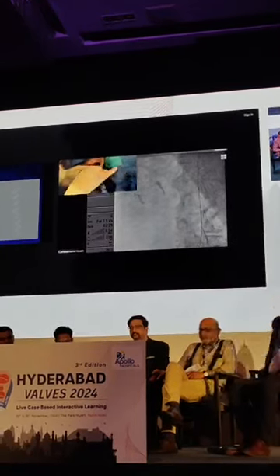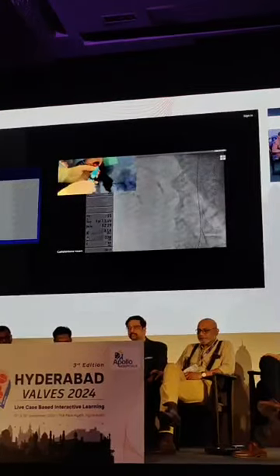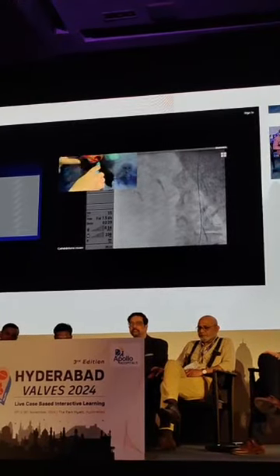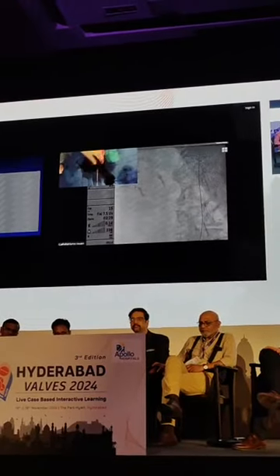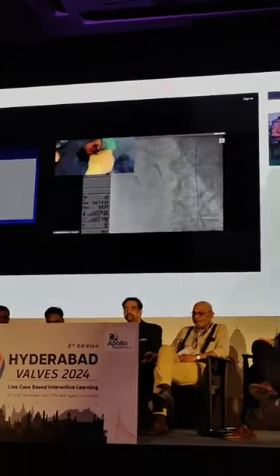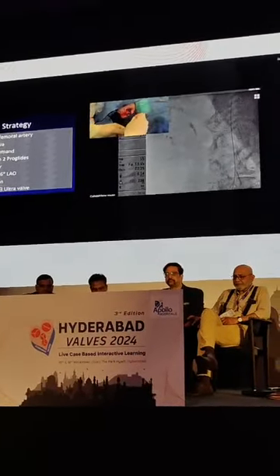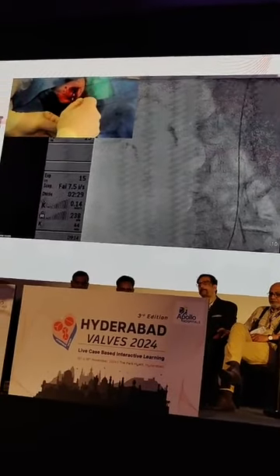She pulled on the lever, pulled the device, and then pressed on the plunger, removed the needles, and we cut the two threads. She pulled back the lever, pulled the device, and now we are going to insert the guide wire again. We put the thread on the side. We don't use it until the end. I reintroduce the wire in the small hole, so we have access in the vessel.